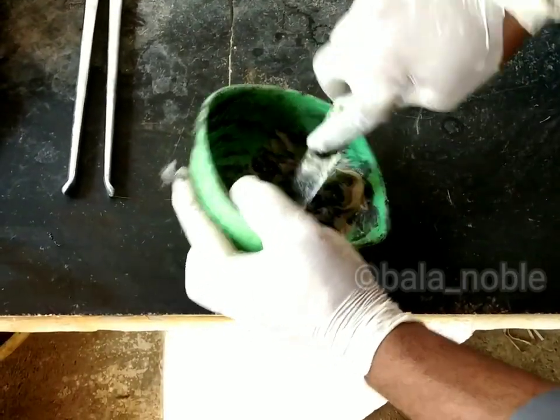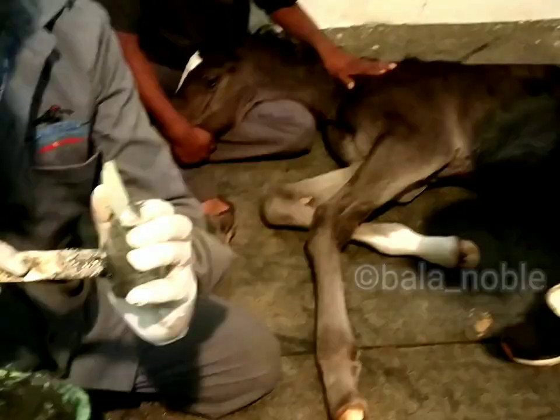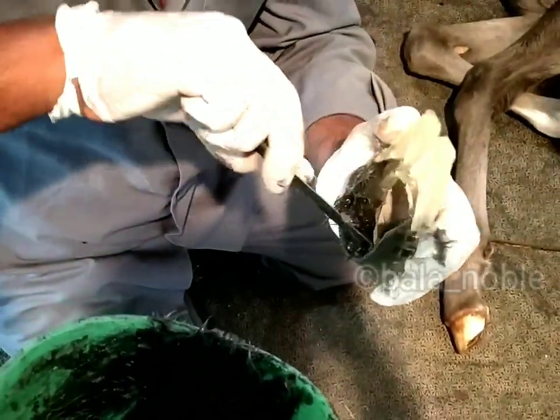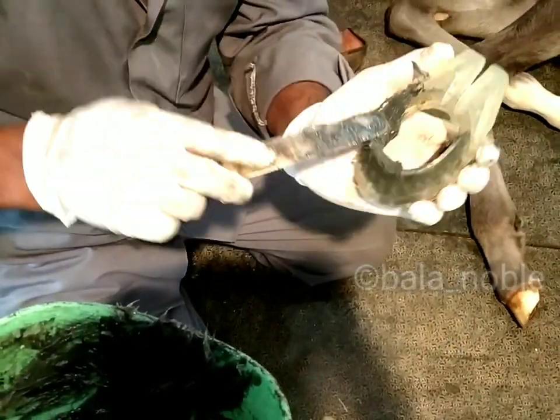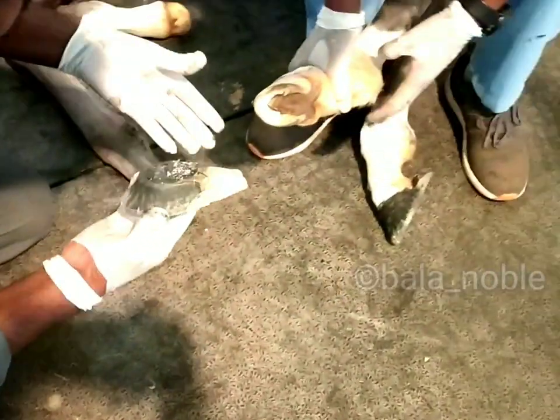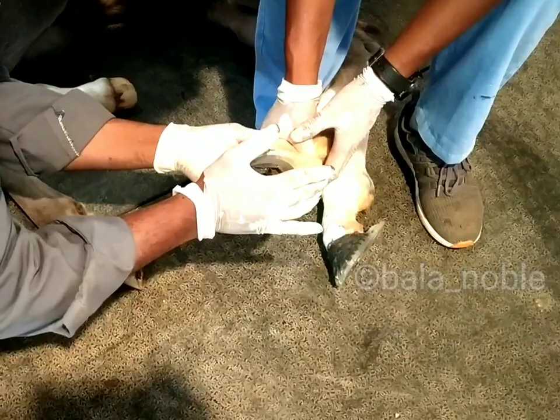Mix it thoroughly — it will become like a tar material. Apply it inside so it will be attached to the whole hoof. The foal is sedated now, so that it will be easy to do our job.